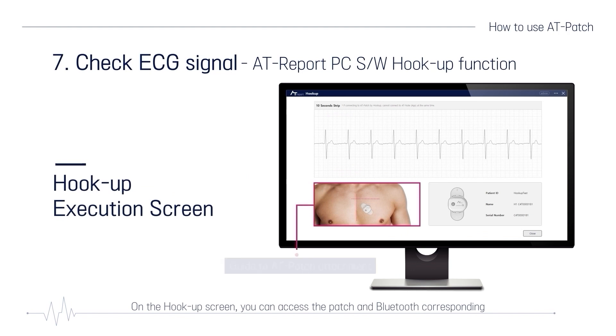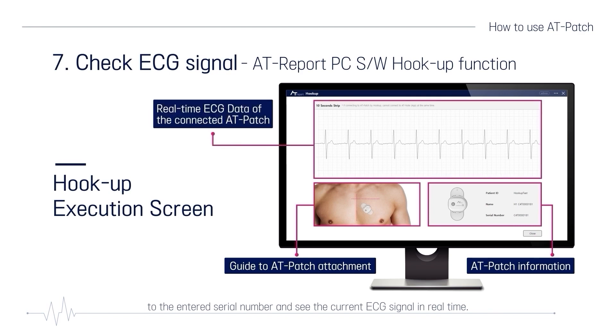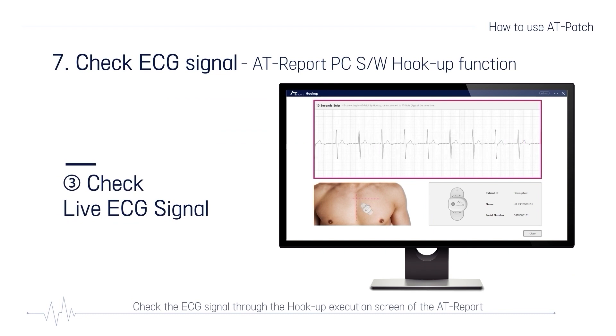On the hookup screen, you can access the patch and Bluetooth corresponding to the entered serial number and see the current ECG signal in real time. If the patch is already connected with the AT-Note app through Bluetooth, it can't be connected to a PC through Bluetooth. In this case, disconnect Bluetooth with the AT-Note app and connect the patch to the PC through Bluetooth. Check the ECG signal through the hookup execution screen of the AT-Report if the patch is attached in the correct position.